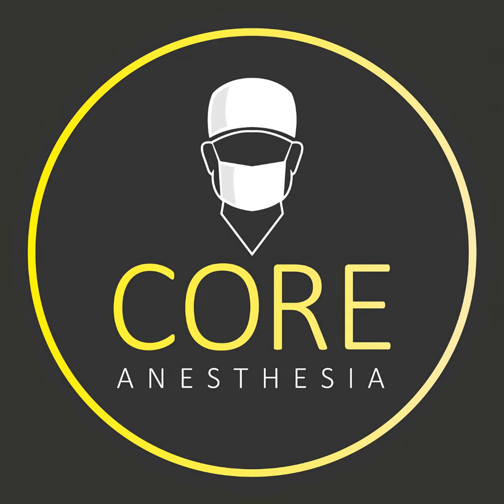It's also important to note that the more peripheral you take the blood pressure on the body, so let's say you have the patient in a supine position and I put the cuff on the distal portion of my calf, the farther away in that periphery I am, the higher my systolic and the lower my diastolic is. So that pulse pressure is going to become wider the further in the extremities you get. I'm not talking necessarily here in elevation. This is more just if you're supine. The more peripheral you are, the bigger that gets.